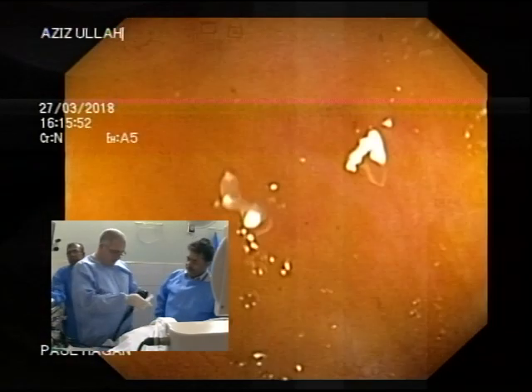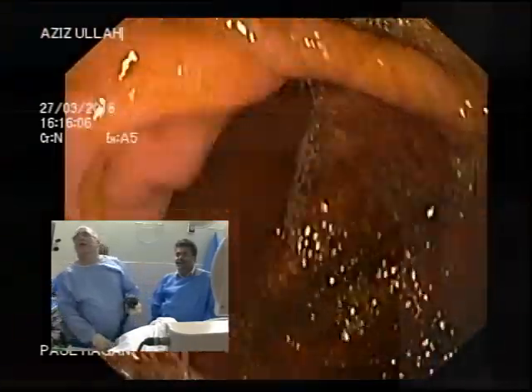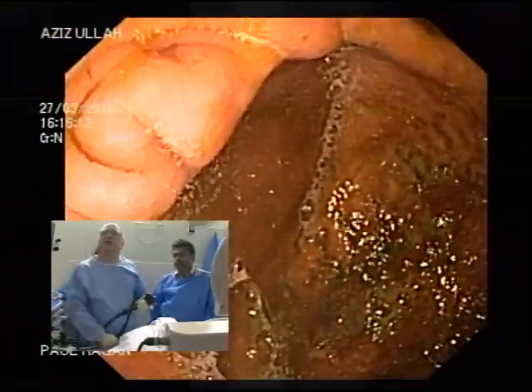No, not opening. One more go. Dr. Paul, would you like to try the forceps technique? Nope. Why? Any specific? Because I'll be going blind. I don't like to go blind. I can see where it wants to go. Okay. If it doesn't accept the scope, there is a reason why it doesn't accept the scope.